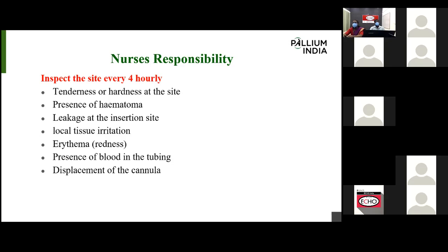Then in some situations, displacement of the cannula may also occur, because it may be accidentally displaced. In these conditions, we need to inspect every 4th hourly. If we notice any such situations, we need to change the site and resite for the subcutaneous injection.